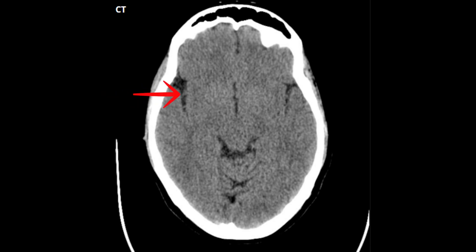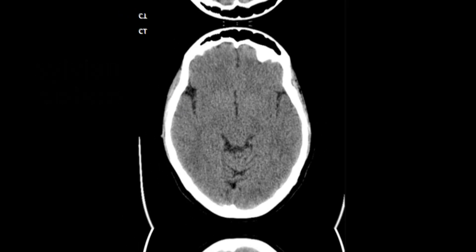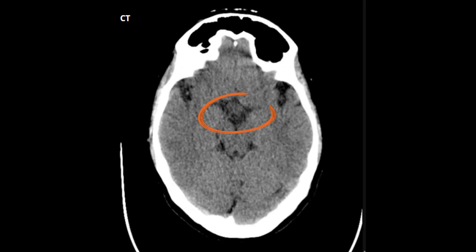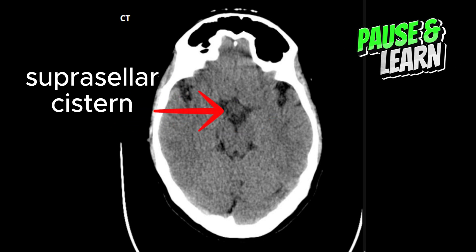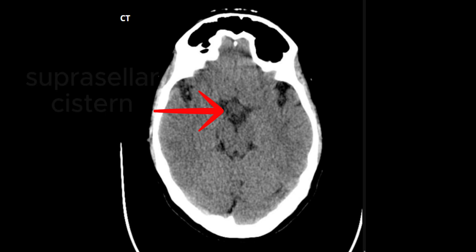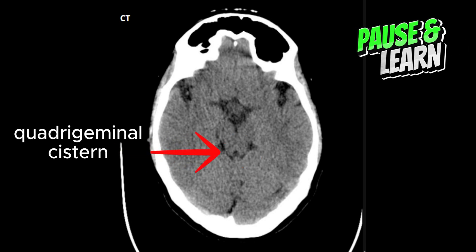This area separating the frontal lobe from the temporal lobe is the sylvian cistern. This cistern lying above the sella turcica is the suprasellar cistern, named according to its location. This W-shaped cistern lying posterior to the midbrain is the quadrigeminal cistern.